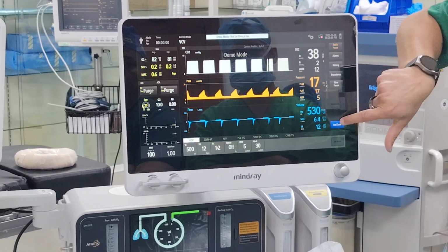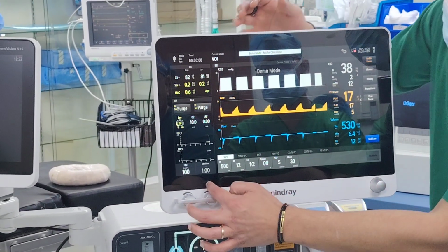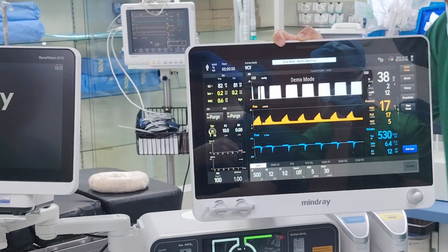So we will start this again. And the flow is not showing anything, any change. It will not show you down there, doctor, but where you will see it, it's a good question, you will see it here. You see? It's showing here. 10 liters.